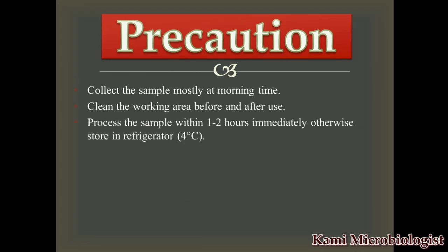Once the sample is collected, you must process it within 1 to 2 hours, because if you don't, there will be contamination, and the bacterial growth will be suppressed by other bacteria, and this will generate a false report. Let's suppose you perform the work tomorrow, then you must store it at 4 degrees Celsius. It will reduce, or we can say stop, the bacterial growth.